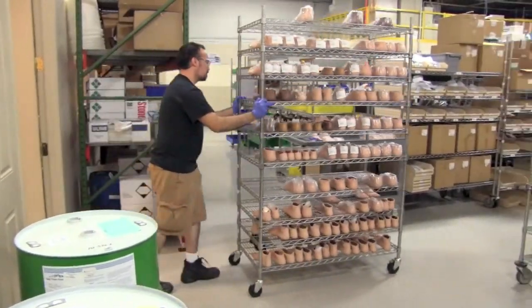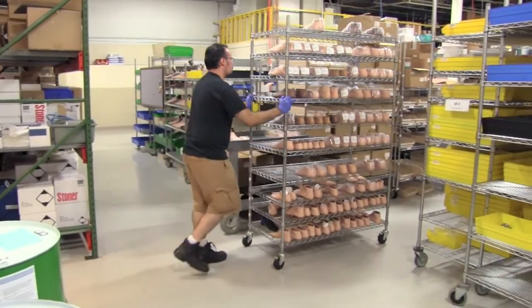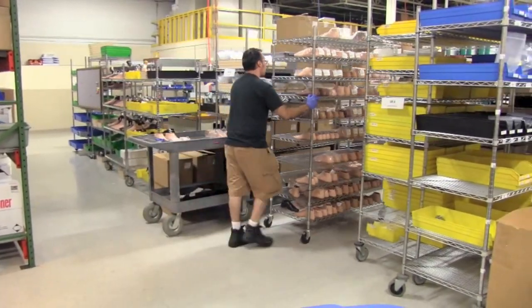We engineer proprietary molds and use a special automated injection process for precision control, creating beautiful seamless shells that mimic an anatomical foot.